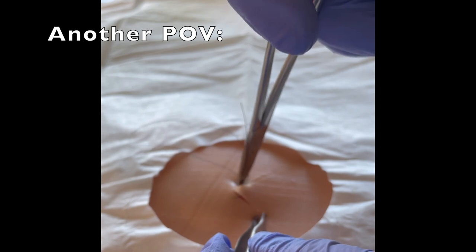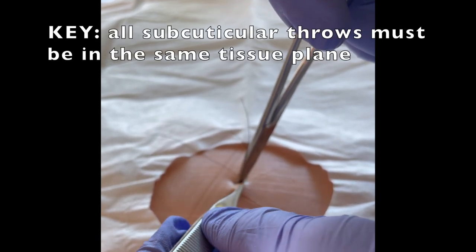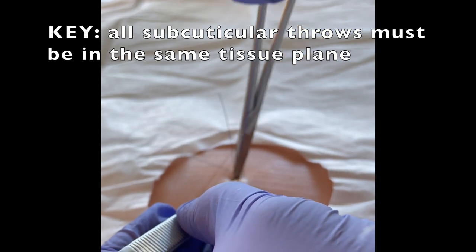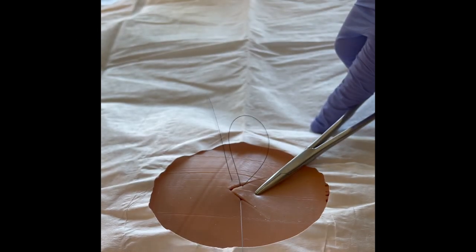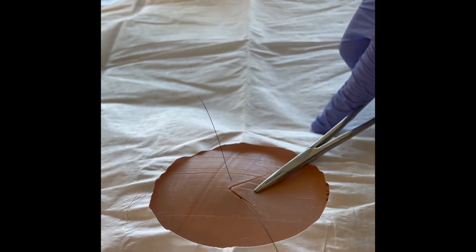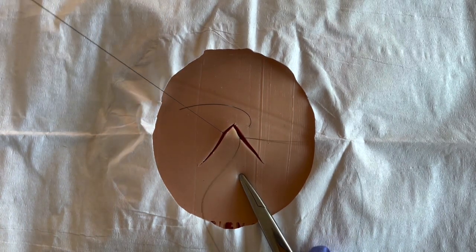Now it's really important that your subdermal, subcuticular throw is in the same tissue plane as where you exited the tissue for your first throw that went epidermal to subcuticular. Otherwise you can end up unintentionally burying that flap edge.